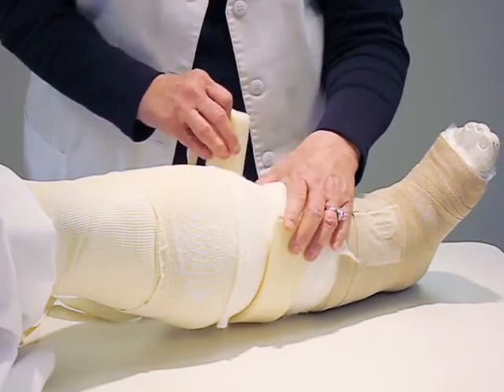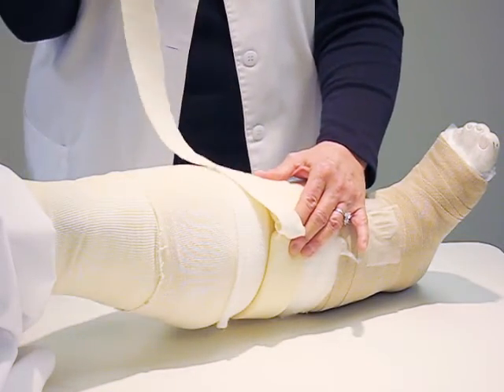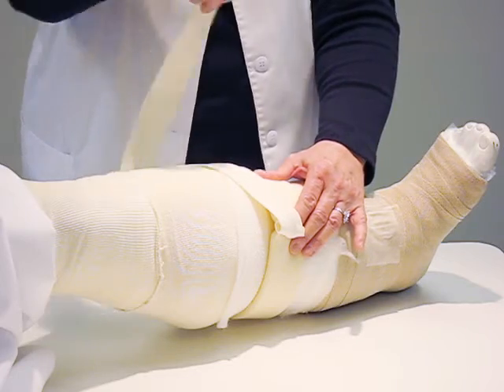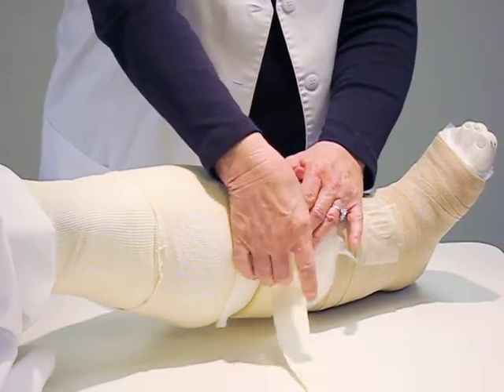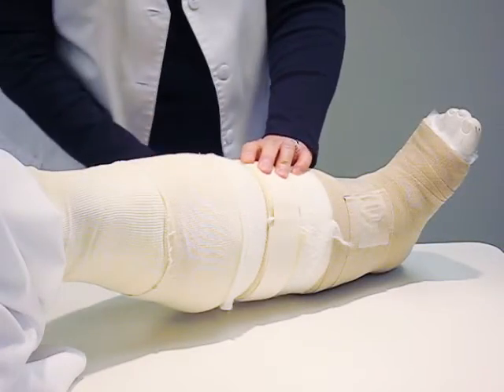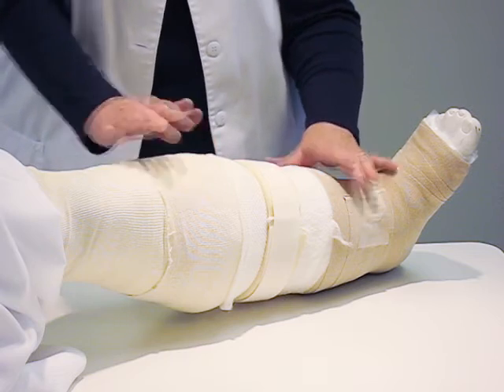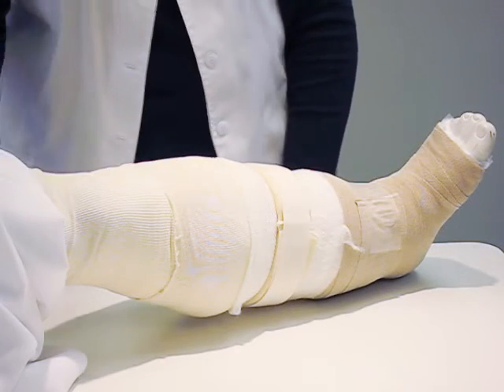Apply the crevice collar wedged side down, wrapping the crevice in the limb so that the flat side is flush with the skin. Fill the entire crevice with the crevice collar and secure the attached finger band. Finally, hold everything in place with a small piece of tape. This will give you a nice smooth contour around which the compression wrap can be applied.